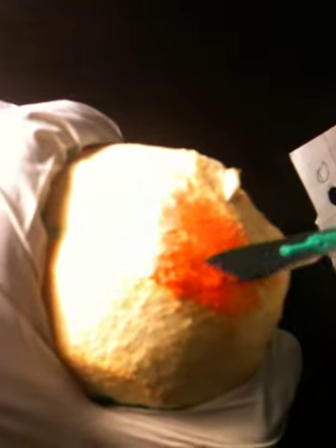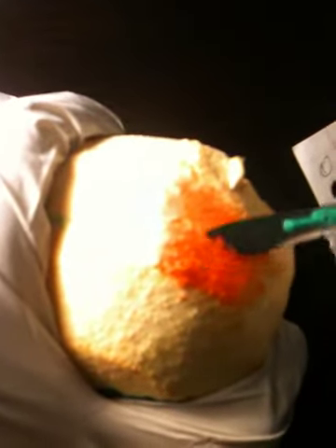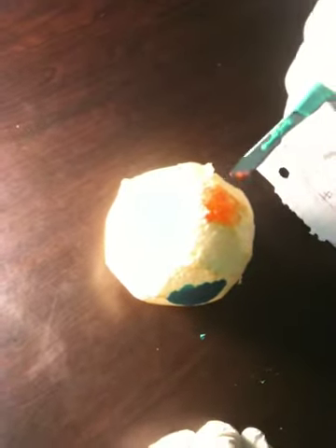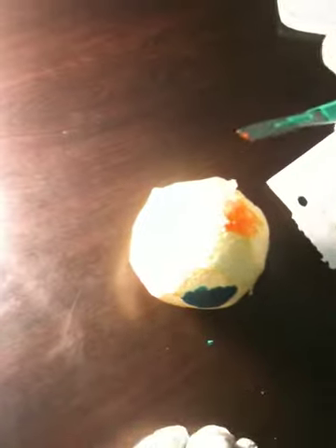Going gently, you can still see some dead necrotic tissue on my scalpel, right? It's pretty simple. You keep debriding until you are able to debride the maximum of the tissue.